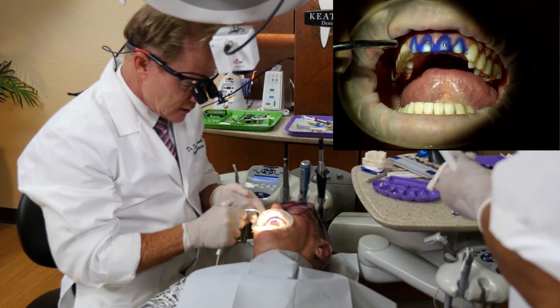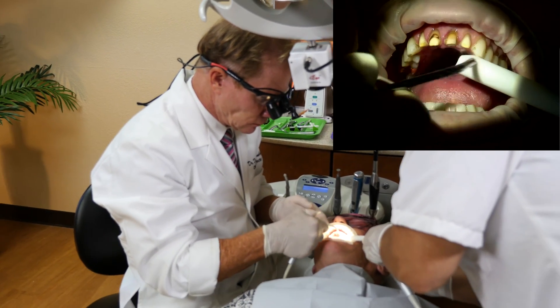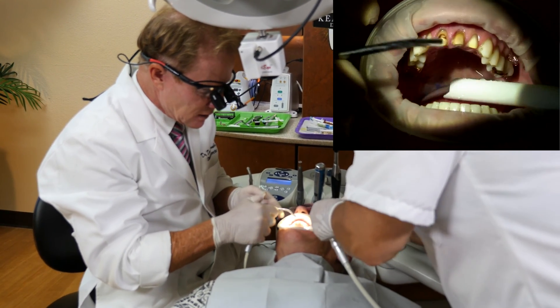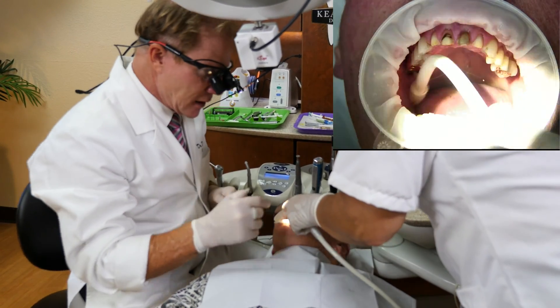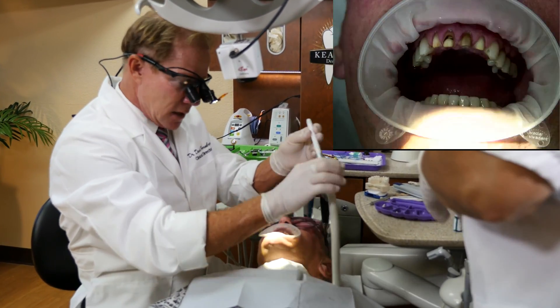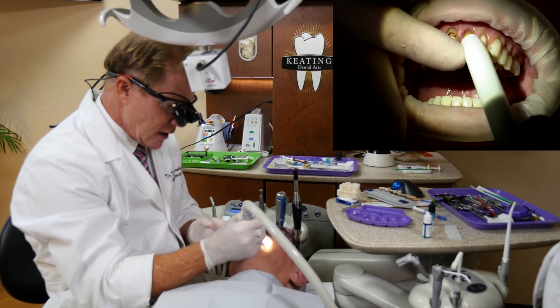Okay, you might have a bitter taste. With a total etch technique, we don't want to bond to wet or dry dentin. So what I like to do is rinse, but don't completely dry. Then I take my high speed vacuum and just remove the excess moisture.